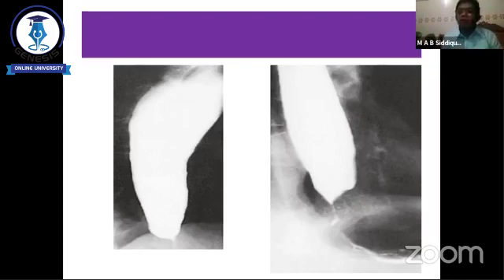And again, in the case of CT scan, we use both oral dye and IV dye, and the time is also important. What we want to see is also important. According to the timing, in the oral route, the dye is the same, barium sulfate.